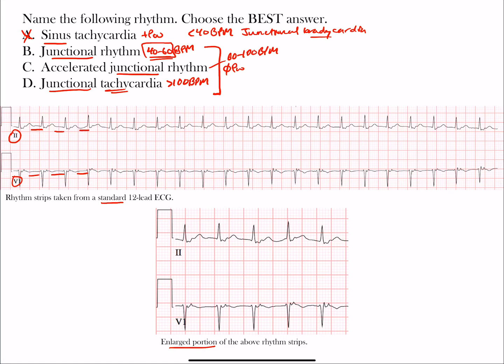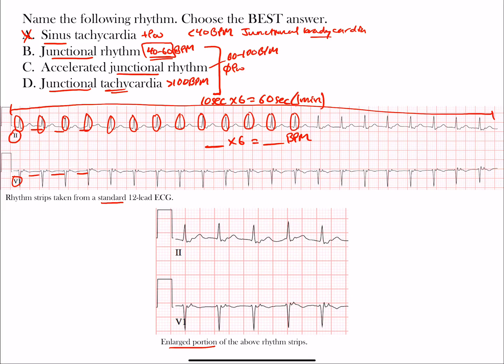We can differentiate these three based on rate. From beginning to end of our standard 12-lead ECG is 10 seconds. Times 6 equals 60 seconds, which is one minute. If we count the complexes across and multiply by 6, we get the rate in beats per minute. Let's count: 1, 2, 3, 4, 5, 6, 7, 8, 9, 10, 11, 12, 13, 14, 15, 16, 17, 18, 19, 20, 21.